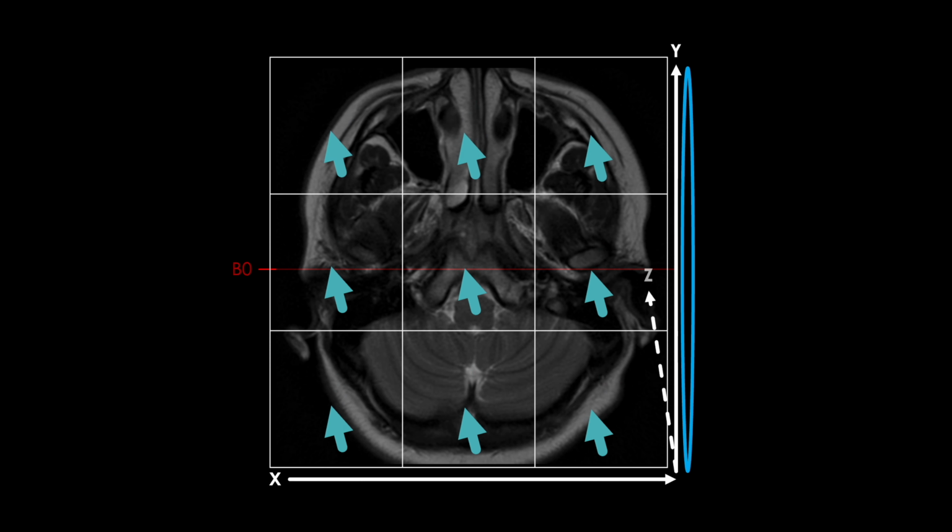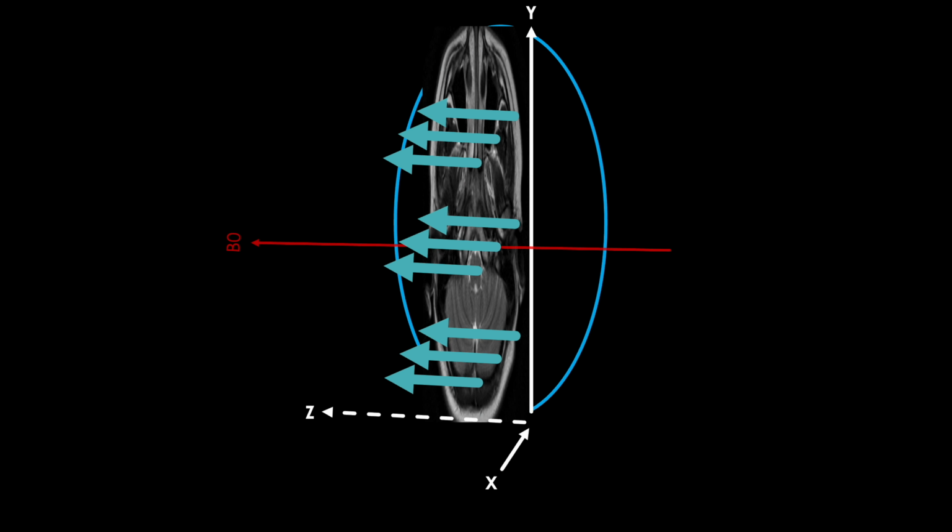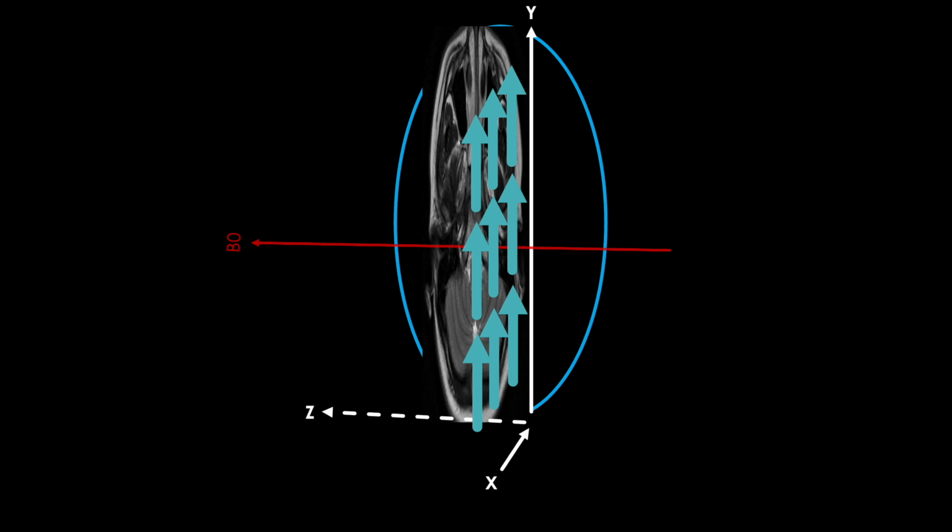You can see why we started drawing them the way we did. This is more complicated to visualize, but if we change our view again to the side of the slice, it makes much more sense. So let's go through some of the steps we already know. We'll excite the system with our RF pulse. Let's choose a flip angle of 90 degrees for this example, and when applied, all the net magnetizations from each voxel will be knocked 90 degrees into the XY plane, nicely aligning with our slice.